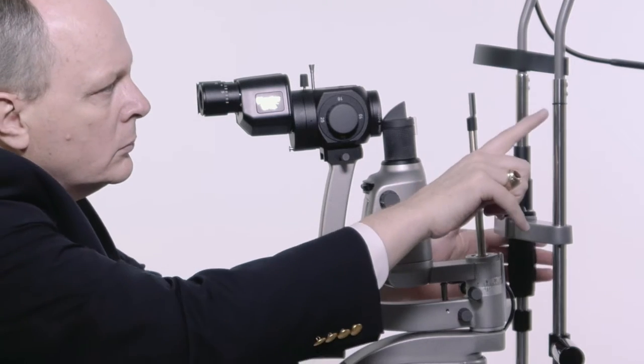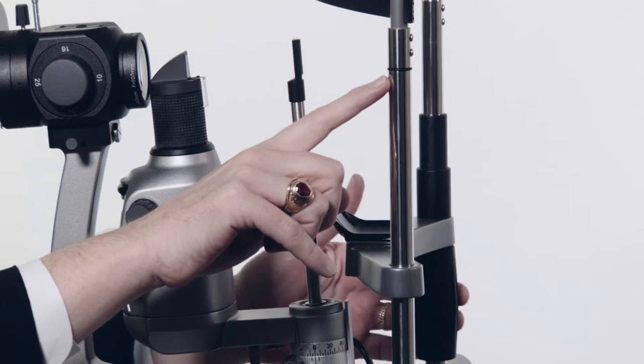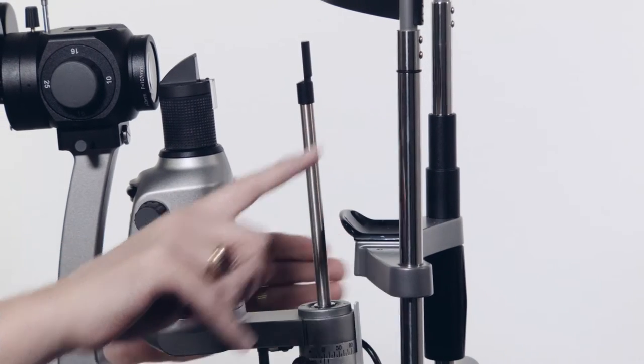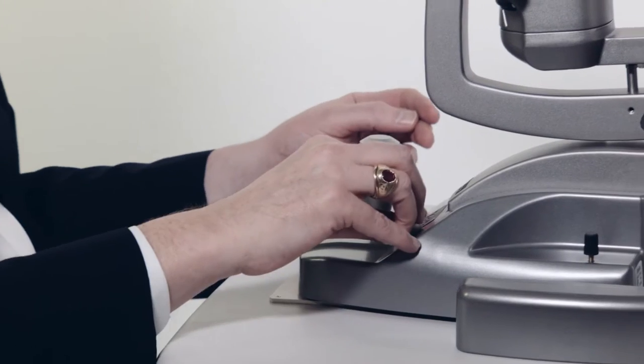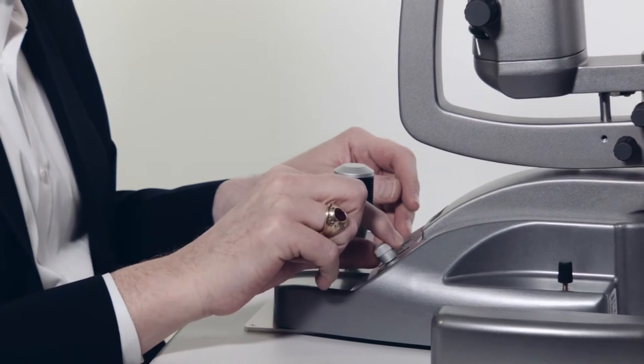Adjust the chin rest height so that the patient's eyes are level with the height mark on the chin rest support. Switch on illumination using the main power switch. Adjust illumination using the rheostat near the joystick.